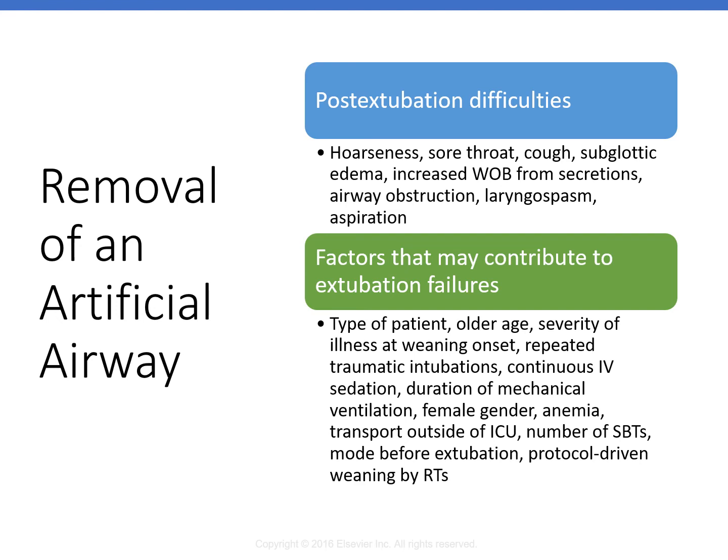They can have laryngospasm after you extubate. That's probably on you for not extubating during end inspiration, but hey, that's my thing. Don't tell people to cough and pull it out while they're coughing. You're just asking for stridor and edema and all that good stuff, but that's my viewpoint. Post-extubation edema can result in obstruction of the airway and cause stridor.